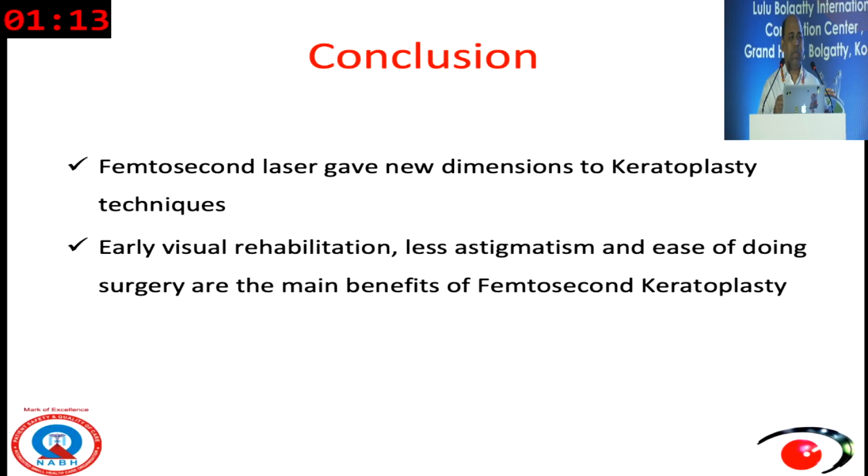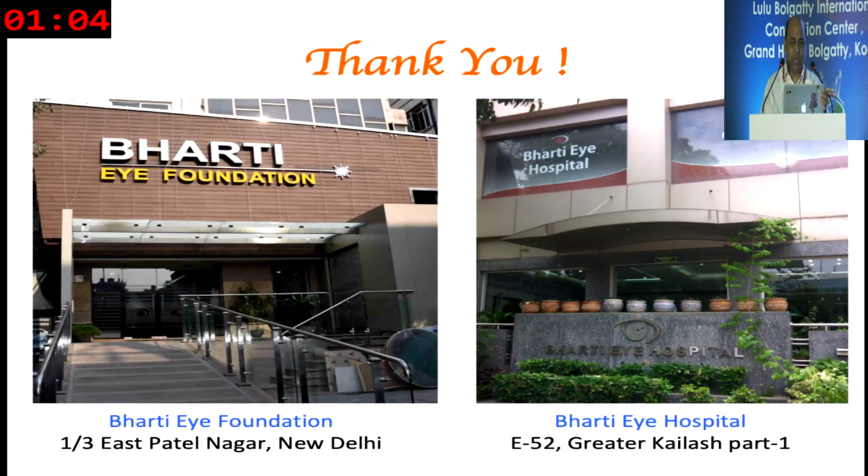So in conclusion, femtosecond laser gave new dimension to keratoplasty techniques. Early visual rehabilitation, less astigmatism, ease of doing surgeries are the main benefits of femtosecond keratoplasty. Thank you so much.